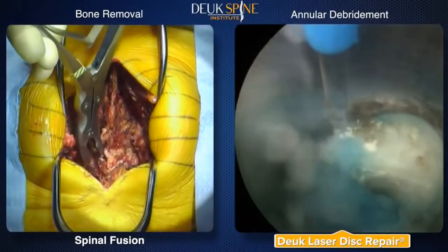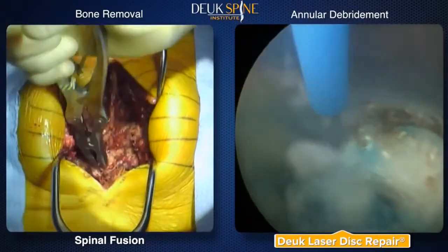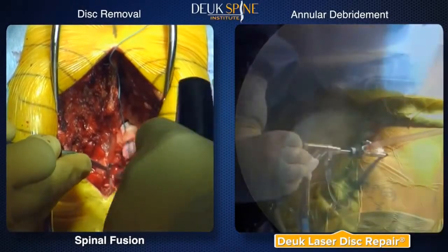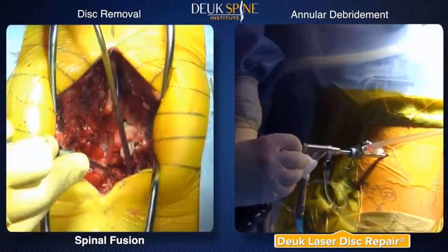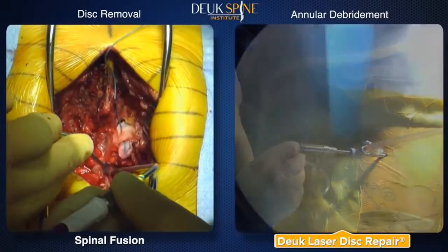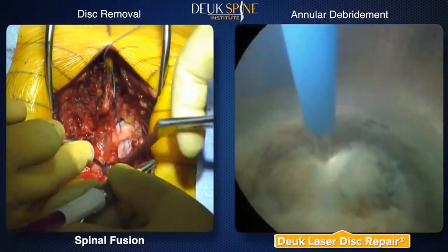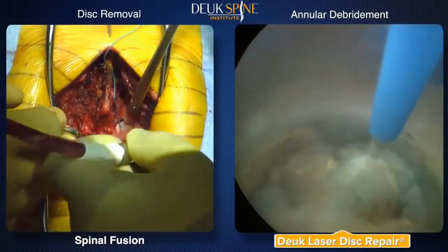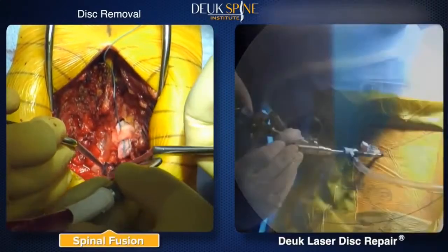In this highly magnified view, the laser is used to precisely remove damaged disc material that is causing the pain. The laser is debriding, or essentially vaporizing, damaged tissue in the disc's outer layer, or annulus, specifically at the annular tear, the source of the rupture or herniation and pain. After the fusion patient's damaged discs are removed.